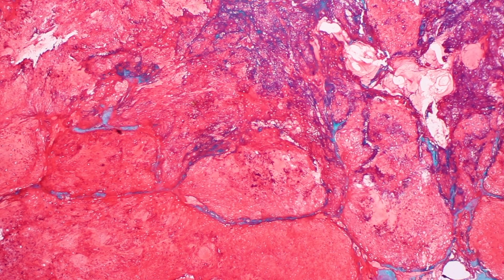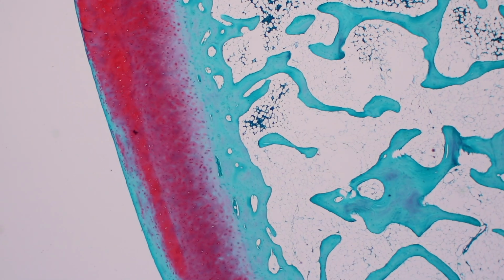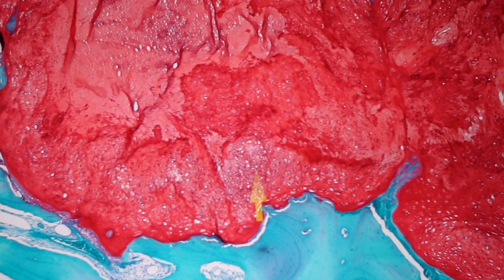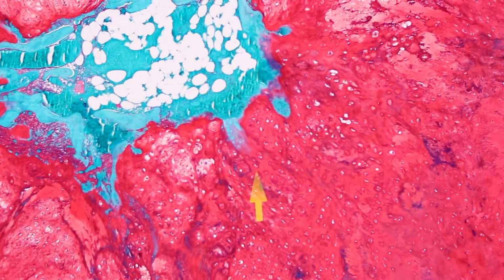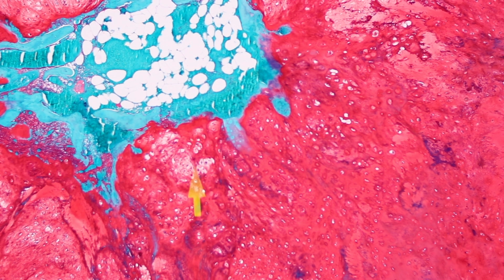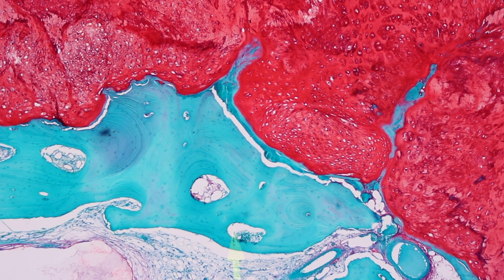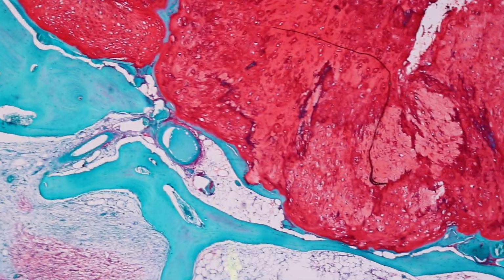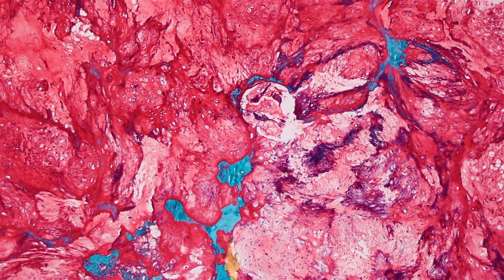So let me go to the articular. Yeah, so this is a safranin O. When we look at the tumor, it stains beautifully with the safranin O. Wow. And it highlights the distinction between the cartilage and the bone. And the bone is often this aqua blue-green in color. Very beautiful. So this would also be a way to highlight infiltration. You can see some little bony trabeculae that are in there.